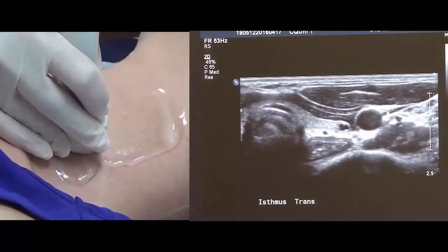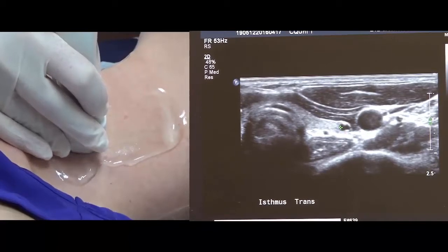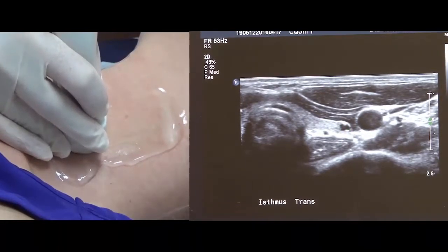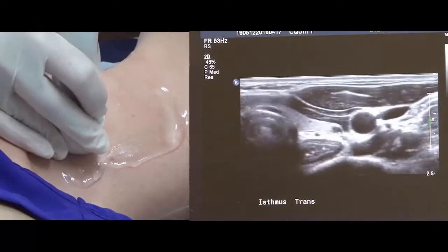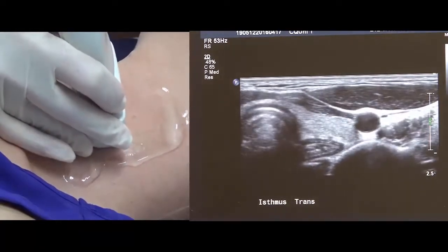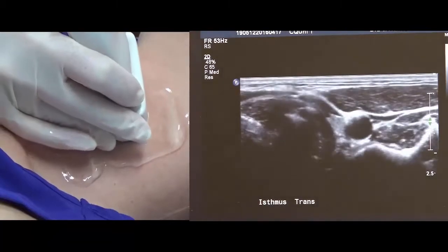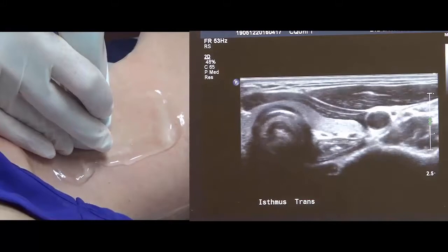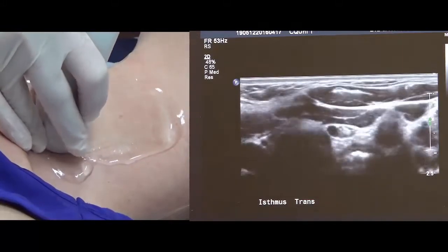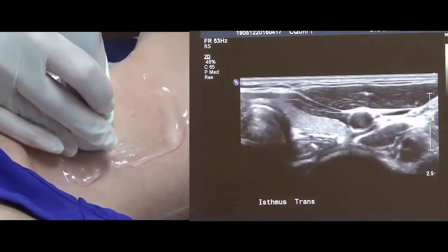There's that little adenoma there. I'm just pointing it out for you, little cyst. Down in the inferior pole, all the way through, back to midline. So that's my contour, coming up to the head, all the way out of the gland. Nice smooth surface, and that's my contour.